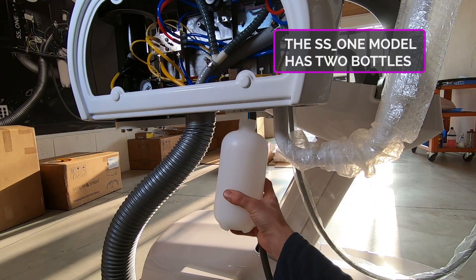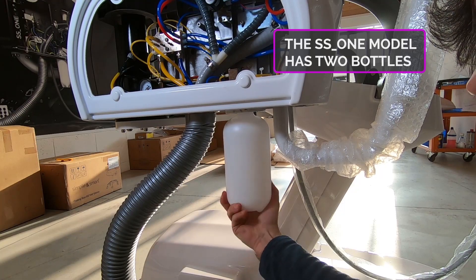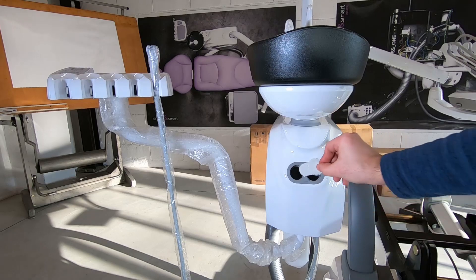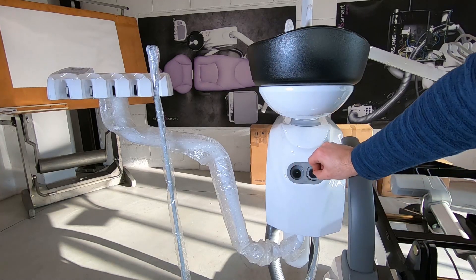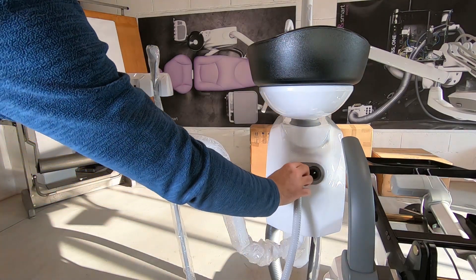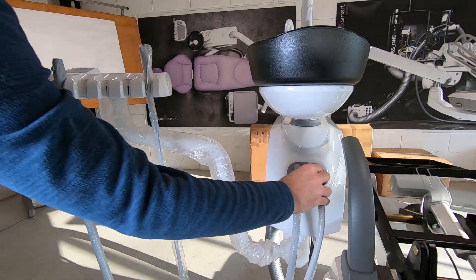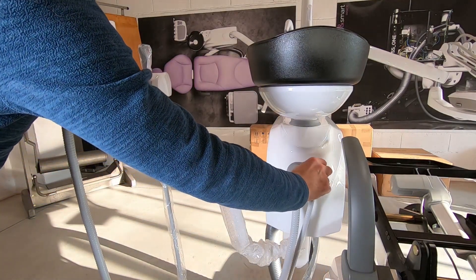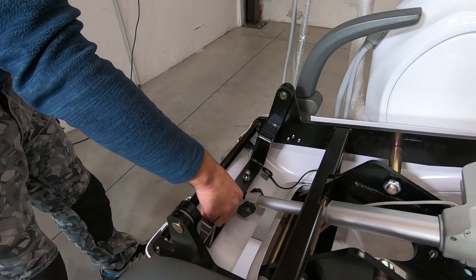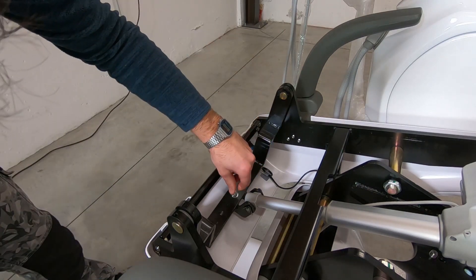Screw the bottle to the water unit. Put the suction filter and place the two suction cannulas.